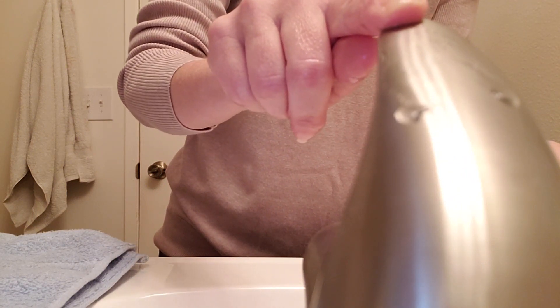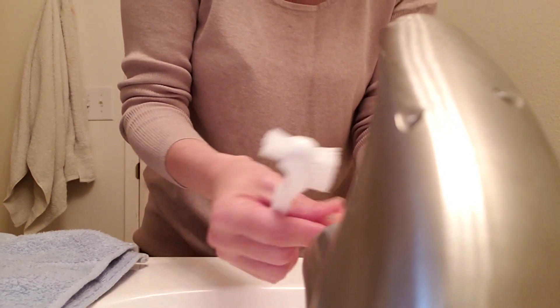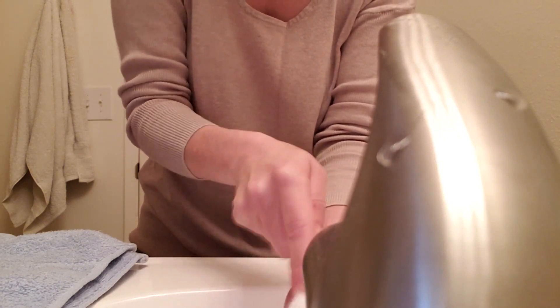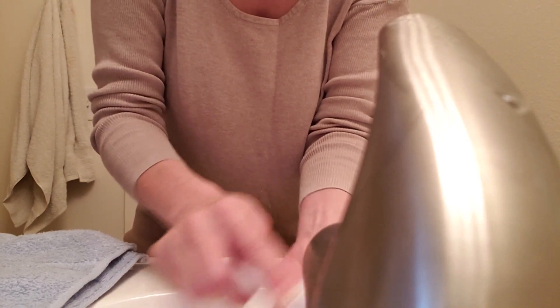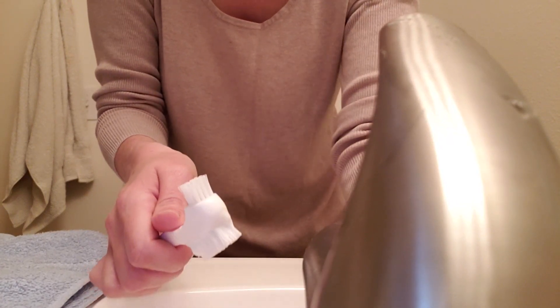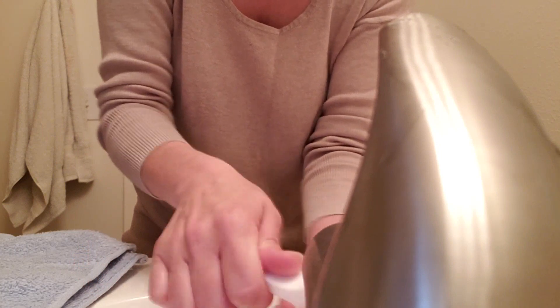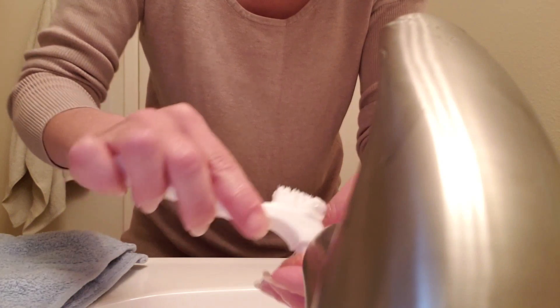Got my brush here. I'm using good old Dawn dish soap, scrubbing my denture really good. I don't use any glue or adhesive on my top — I've been lucky and have a great dentist who is just amazing. So far that's been really awesome. I know some aren't so lucky.